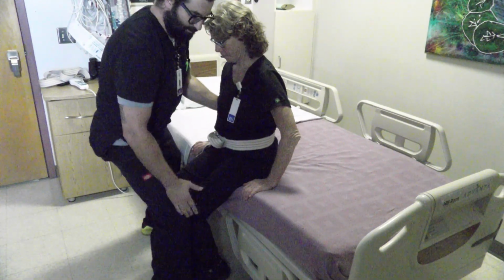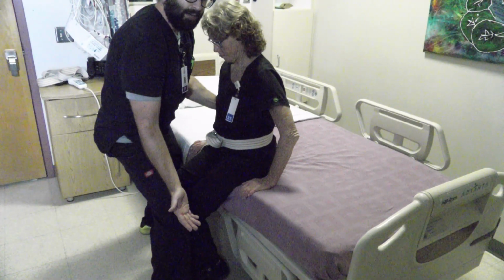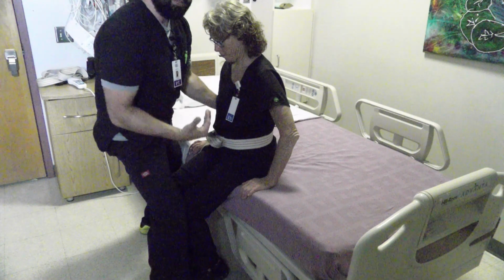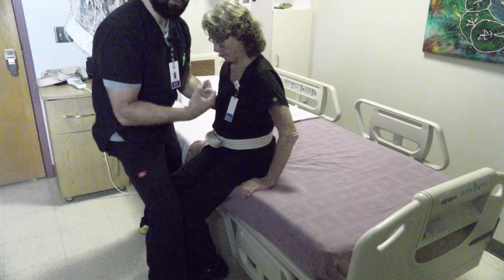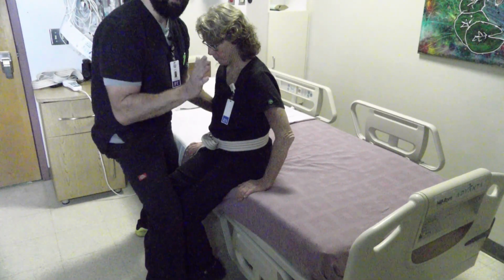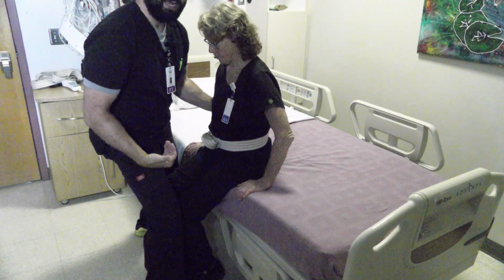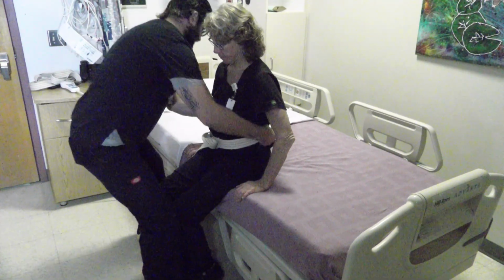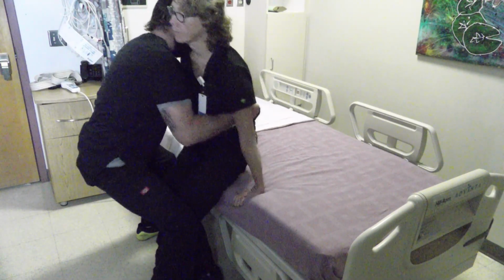I'm going to brace one of the patient's knees on my leg like so, but make sure that you have something on their feet for friction. So at minimum, they should have the hospital socks that we give to every patient that provides that necessary friction to help them stand up so that their legs don't slide out from under them. Okay? So, Miss Patty, we're going to do this on 3. Okay? 1, 2, 3.